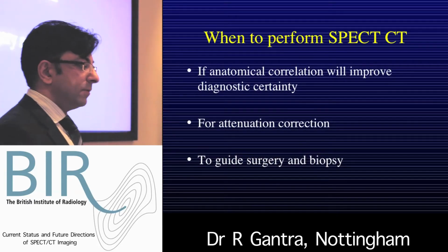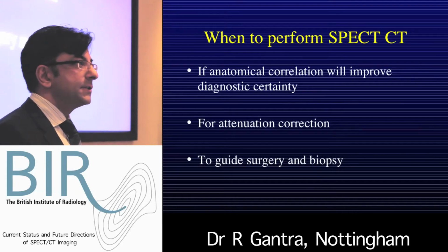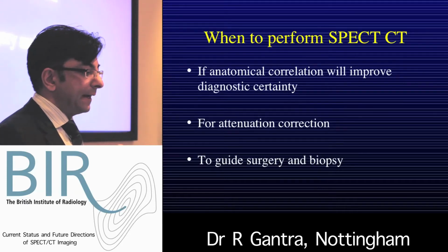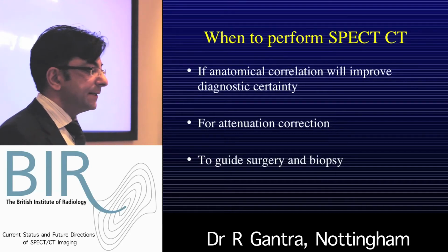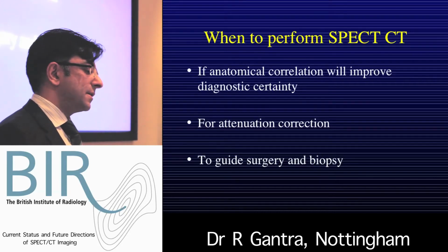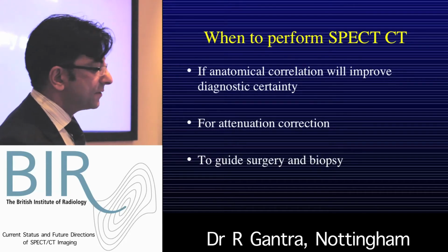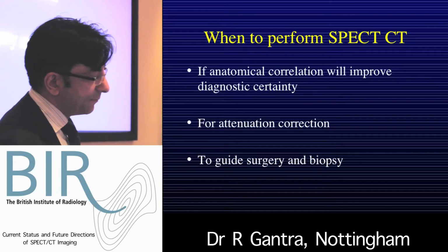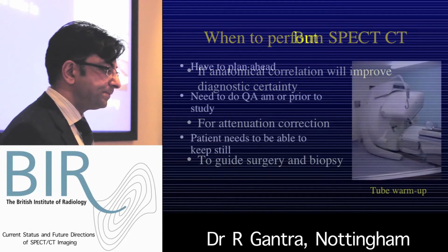So when to perform SPECT CT? Really, if you want to correlate the anatomy and the nuclear medicine data with certainty, you'd like the co-registration to happen. We also use it for attenuation correction, and as some of the speakers will tell you today, it can be useful for guiding surgery, such as for parathyroid scintigraphy, and can guide biopsy on occasion.